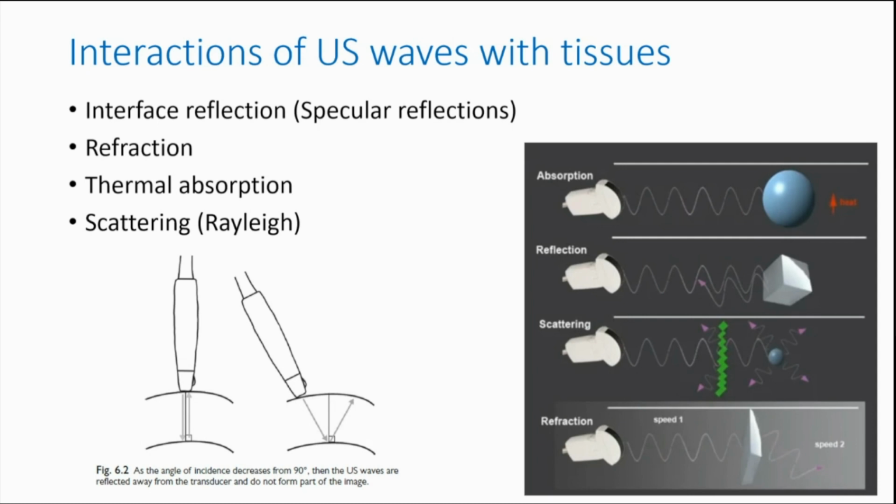This is very easy for some blocks like the femoral nerve, but it can be very difficult for some blocks like the serratus-pectoral block, because in that block the probe is slanted on the chest wall and is not exactly vertical. If you put it vertical, you won't see the rib, so you have to put it slanted. But if you put it slanted, you need to adjust your needle so that it remains in the beam when the needle passes towards the rib.